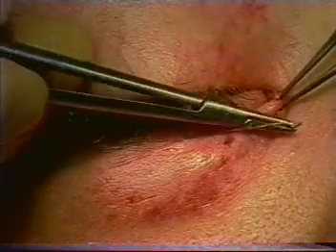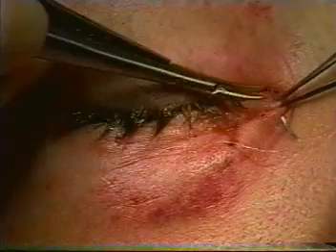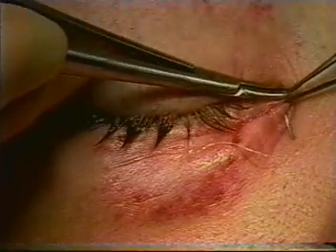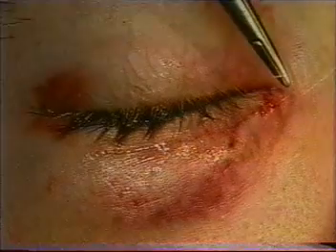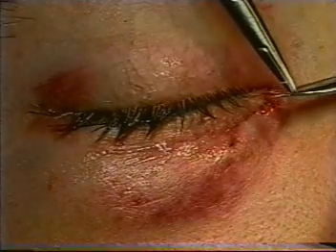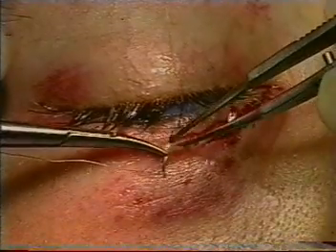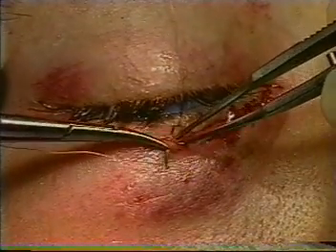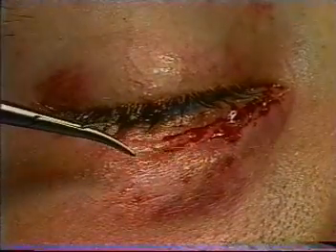The skin can be closed with an absorbable suture, such as a 6-0 plain suture, which will dissolve within five to seven days. All associated lacerations should be repaired at the same time.